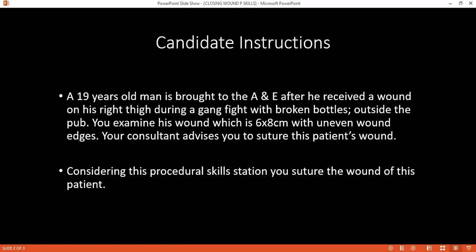When I am done with suturing, I will dress it up. I will tell the patient: as it is an infected wound, I will need to give you one shot of antibiotic and apply a dressing. You can come back within one week for suture removal. For the suture material, I will use non-absorbable braided nylon suture.